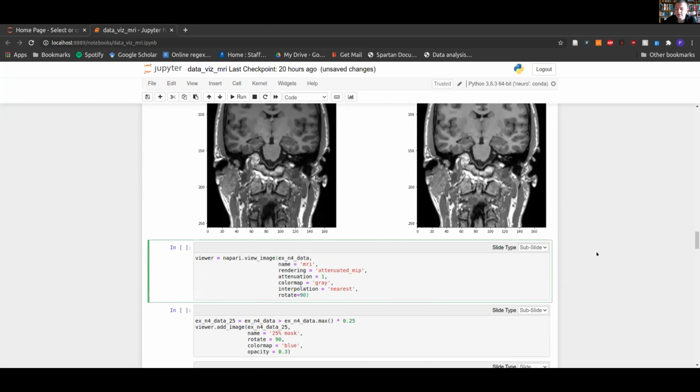So what I'm going to do is give us our first look at Napari. There we go. So I've just opened up Napari, and as I said, it's a GUI-based system, which allows us to nicely, very quickly scroll through this bias-corrected image of the brain. As we can see, all of the voxels have a nice homogeneous look about them. So white matter all looks to be the same kind of intensity value. Gray matter all seems to be the same intensity value, which is very nice and pretty.